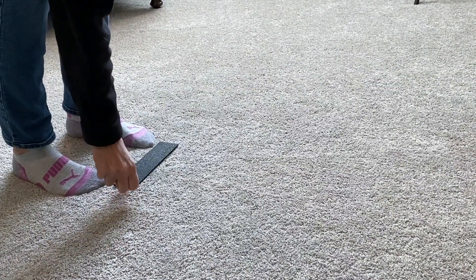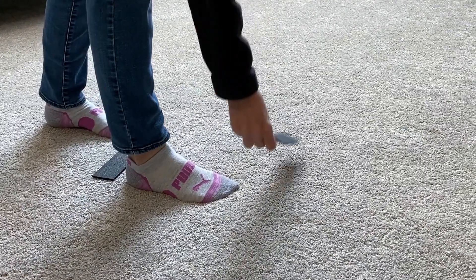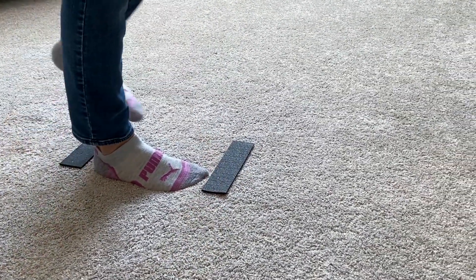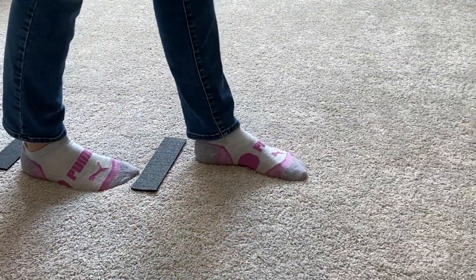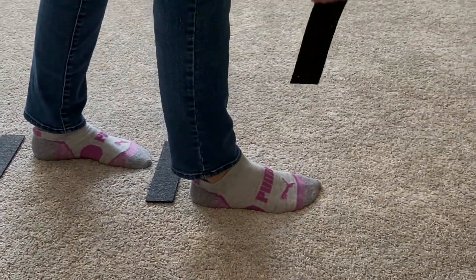When setting up the strips, you put one strip down and then take a short step over it, then place the next strip, and just repeat that. After you have it set up, you may still need to make adjustments once the individual has tried it out.